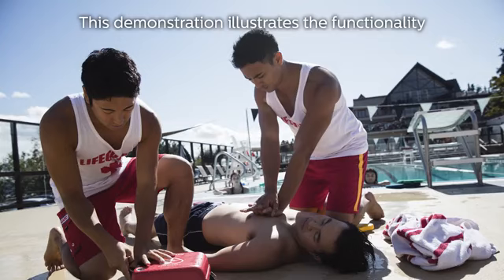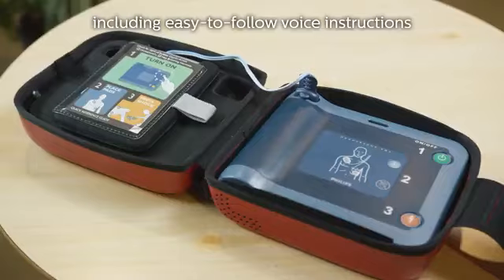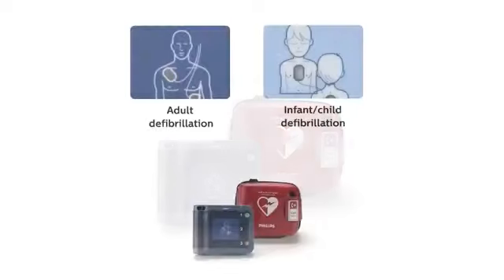This demonstration illustrates the functionality of the HeartStart FRX, including easy-to-follow voice instructions and descriptive visual icons that take you through each step of the process for both adult and infant child defibrillation.